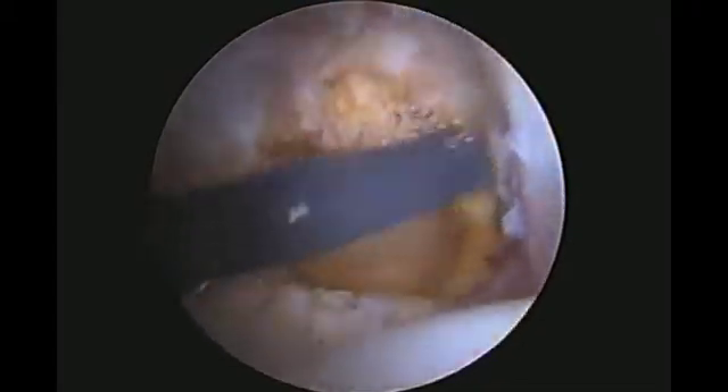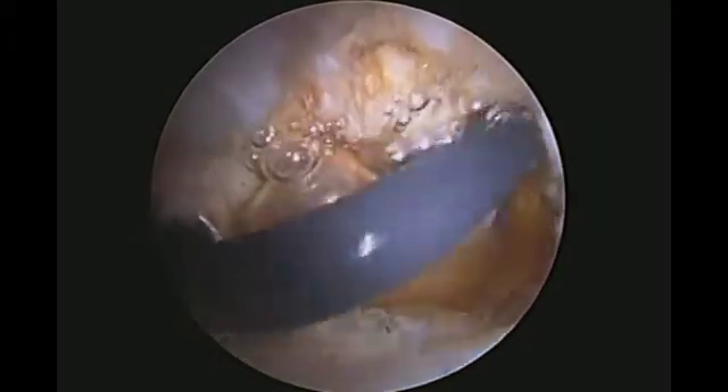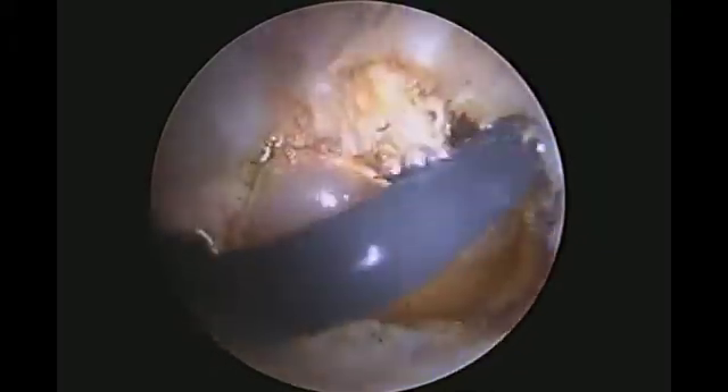The peripheral side of the labrum is released of capsular adhesions. This aids in maneuverability as well as mobilization of the labrum.